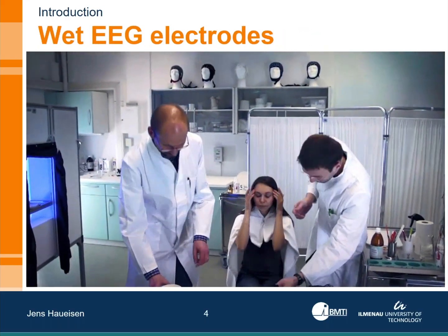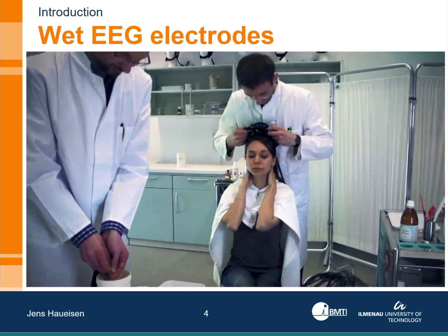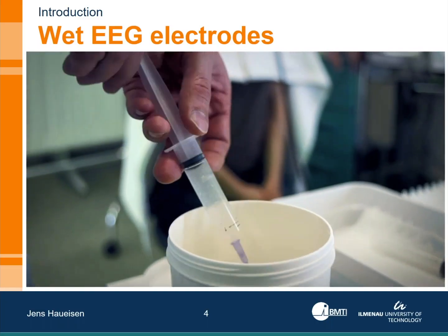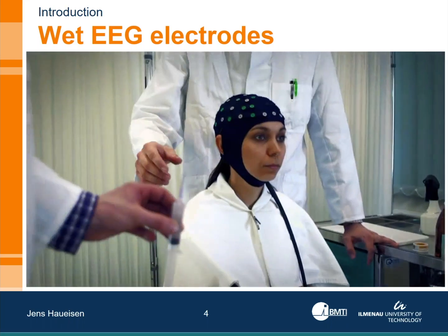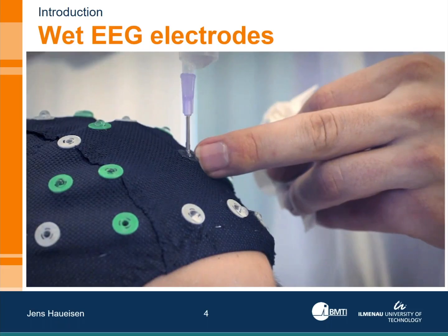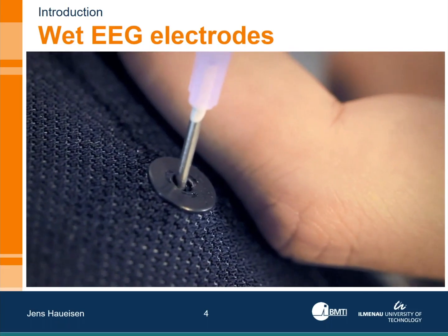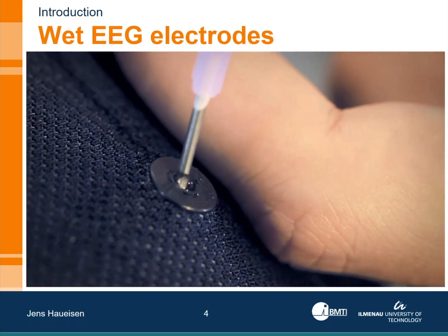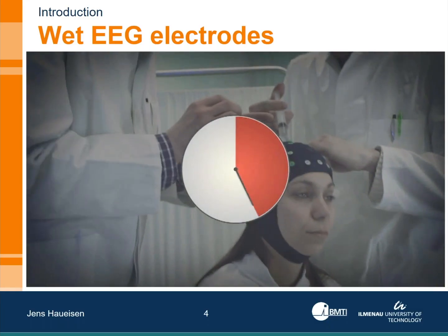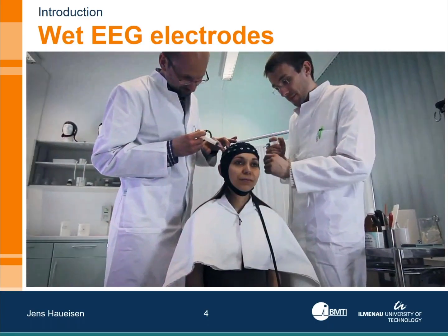You see the typical situation in a lab here. The classical EEG cap will be placed here. Electrodes will be filled with gel. And that procedure, done here by the PhD students, is very time consuming and requires quite a bit of training, as those of you who are within the field know. And depending on the amount of channels, it can easily take up to even 1 hour.